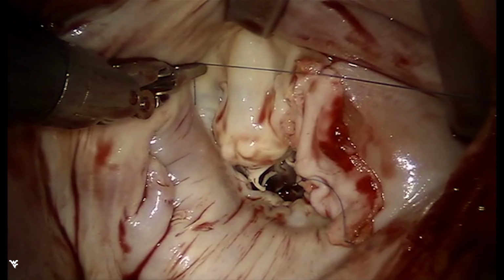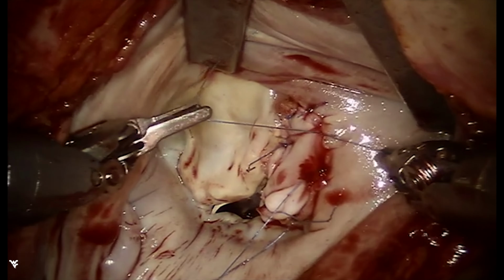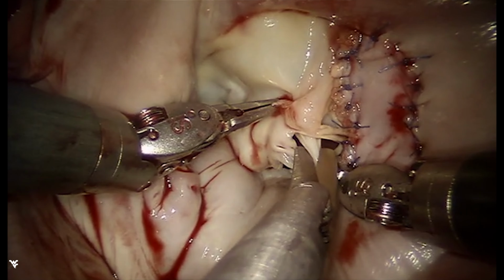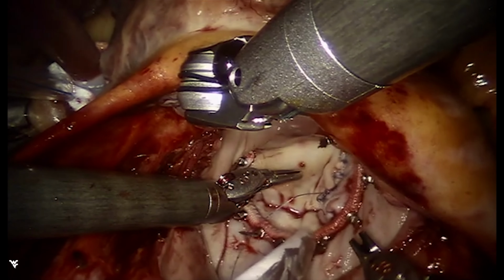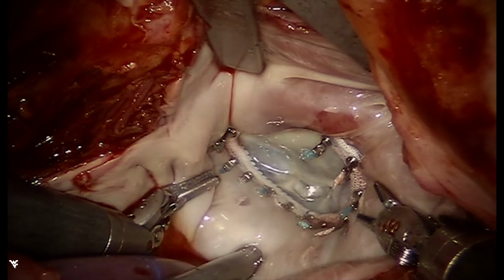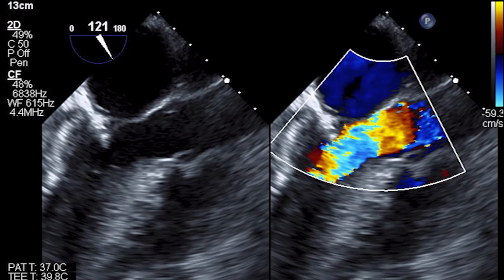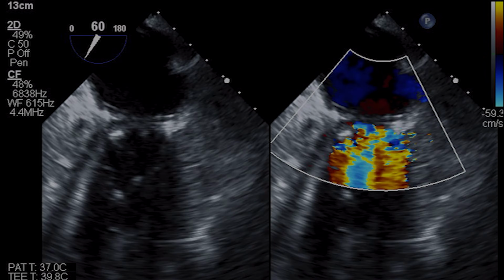Should you choose to utilize this technique, much like for anterior leaflet repairs, please make sure you harvest a large patch. Cannot be too large. Then release of the anterior A3 cords and annuloplasty to confirm the repair without residual mitral regurgitation. So these patients are feasible to be repaired robotically.